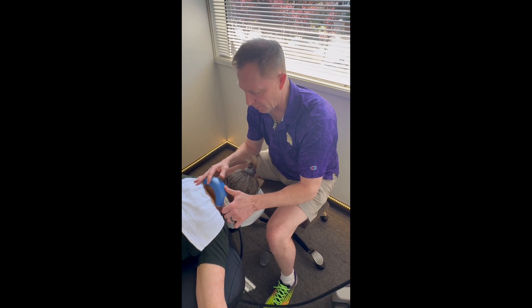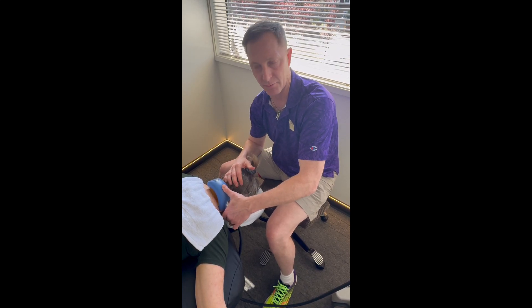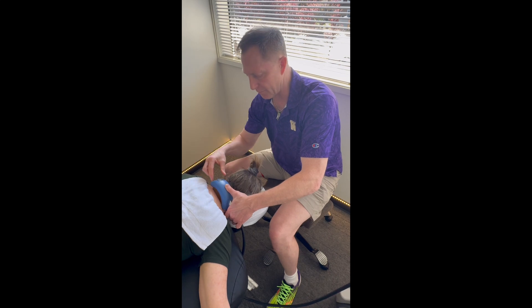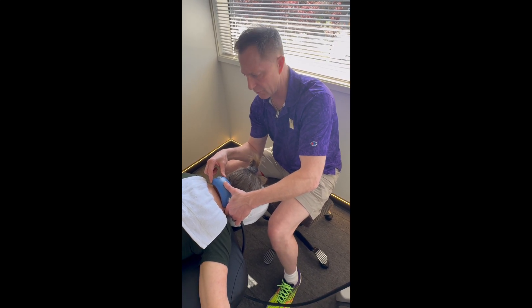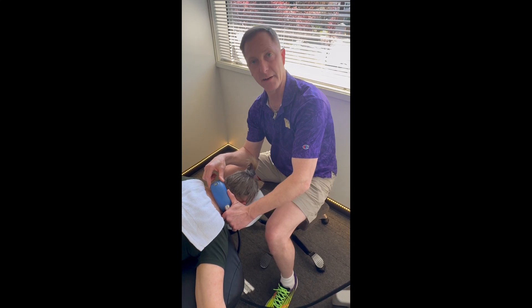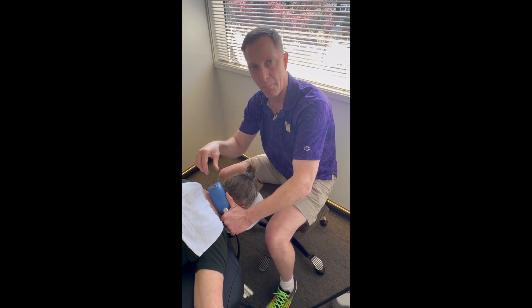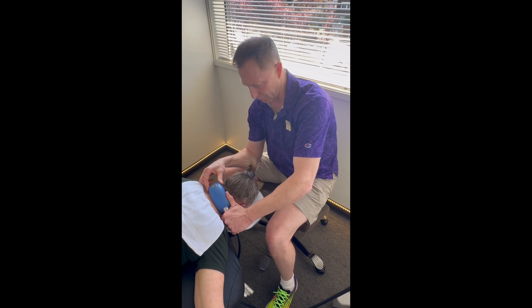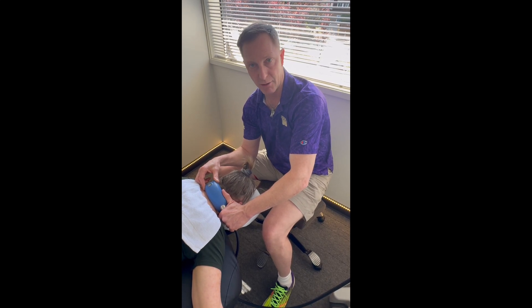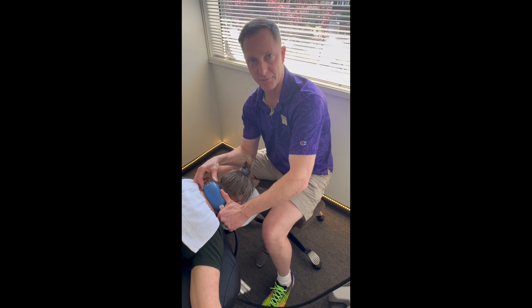We've been doing this for several months now and have gotten the techniques down pretty well. You can see I also apply a bit of pressure. For any therapist out there saying they don't get good results with it — some of it is the pressure, hold, and building up intensity. You also have to educate your patient: if I'm in a place you don't feel anything, say keep moving. If I hit a great spot, say stop right there. And I'll just sit there until she tells me to move, because those sound waves keep bombarding that area with energy. I use a deeper gel pad to get into the nooks and crannies of the spine bones.